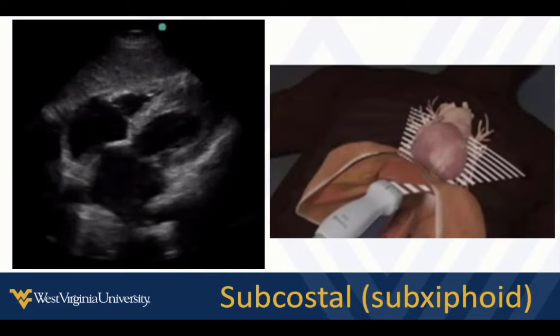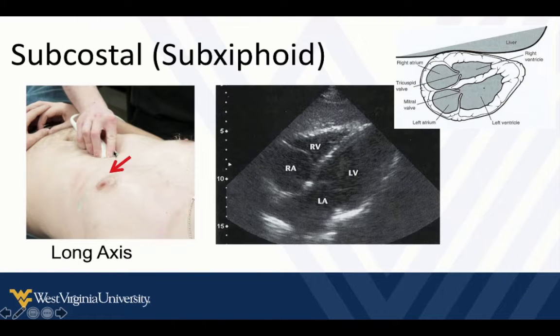If we're in an echo or cardiac setting, our indicator is going to be directed towards the patient's left. We're going to get underneath the xiphoid and really flat on the abdomen, shooting the beam up through the heart. We see this image with the apex on this side of the screen, the base is back here, right is closest to our transducer, and this is the left side. We push into the abdominal tissue to get this view underneath the xiphoid process.